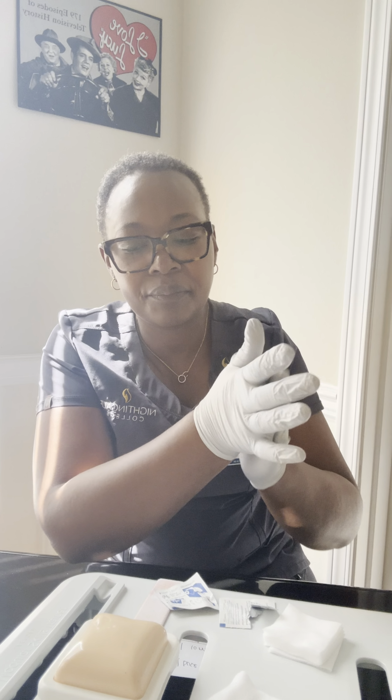I am not going to massage, but I'm going to remove the needle and put it in the sharps. I don't see any concerns, so I'll just wipe it down. And I'm not going to massage, I'm just going to let it be. I will remove my gloves, perform hand hygiene, and document.